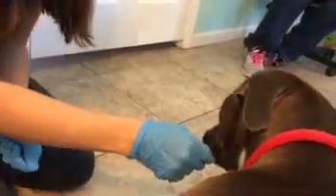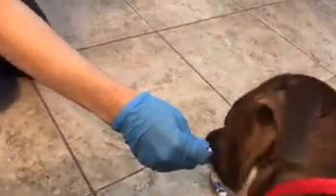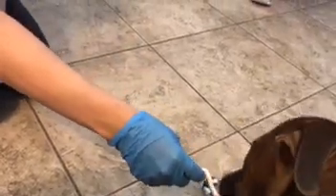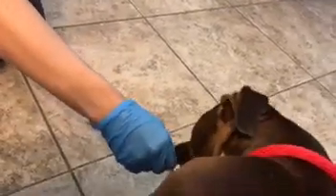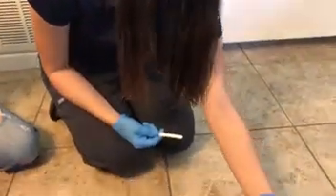And then obviously, you might have a dog that grabs it. It is okay if they chew, as long as they're not tearing it. We never want to get into a tug of war with the dog. If they tear, do we restart? Yes. And it's okay if they tear a little bit off of the dry end too. Let's say the dog broke it off and you were able to get the wet part back, you can still use that and put it in. It's a problem if it rips into multiple pieces. But hopefully if you're doing what you expect to be doing, it's fine.